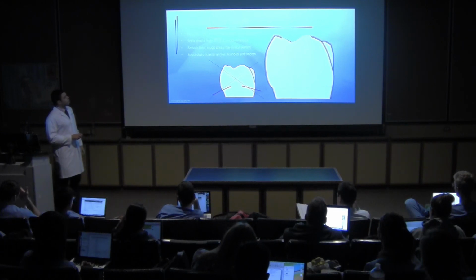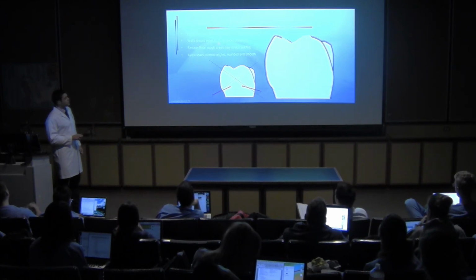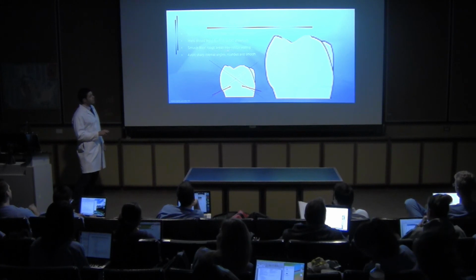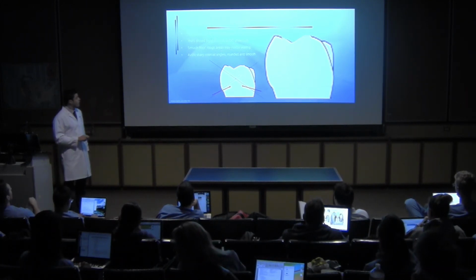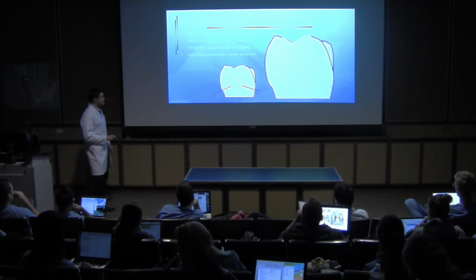So rounded and smooth box shape, avoid sharp corners. Okay. Walls again should taper 6 to 8 degrees. A rough floor with areas may inhibit seating, and avoid sharp internal angles like this.